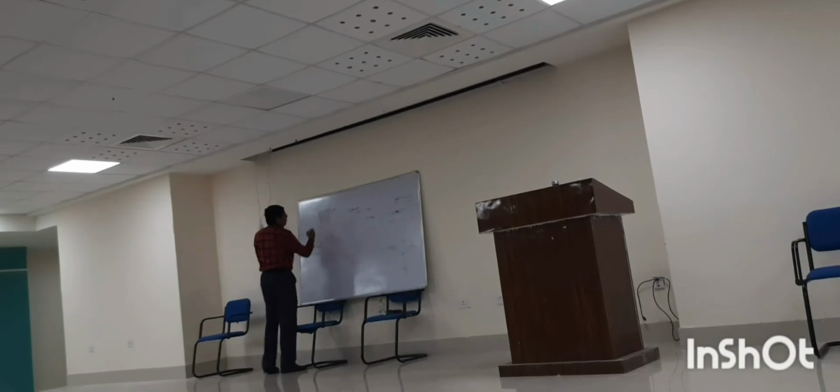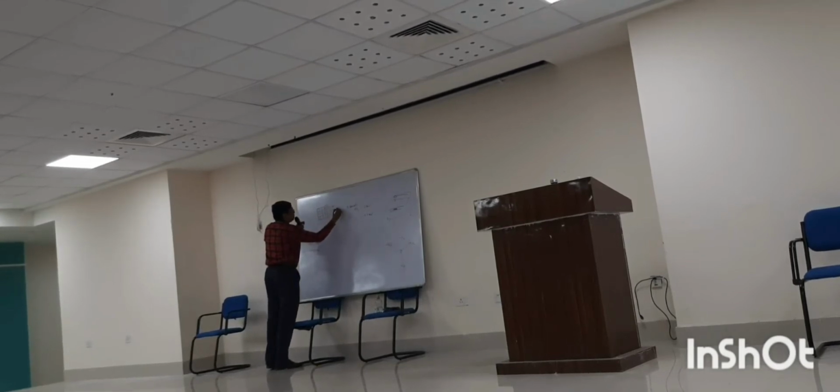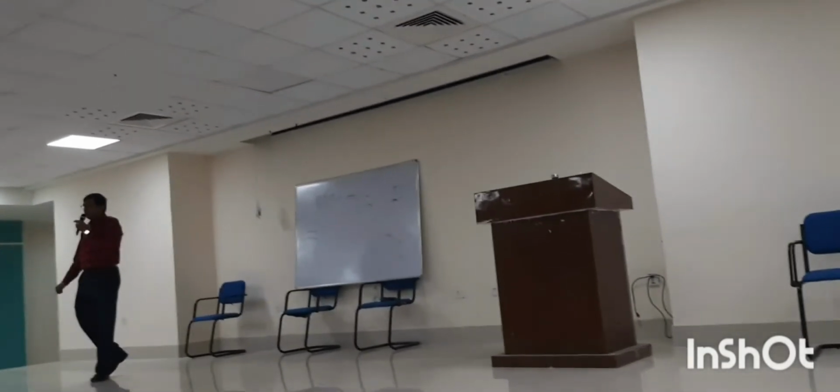So 1 millimeter or one small square is 1 by 25 seconds or 0.04 seconds. So in the tracing paper, each small square is 0.04 second in duration and 0.1 millivolt in amplitude. Now the waves of ECG.